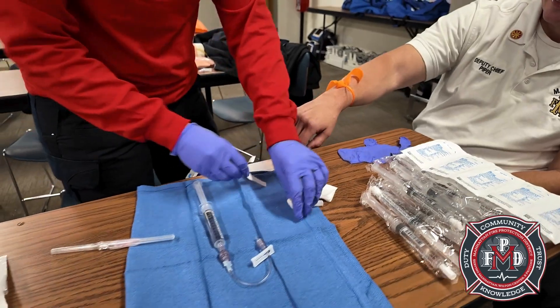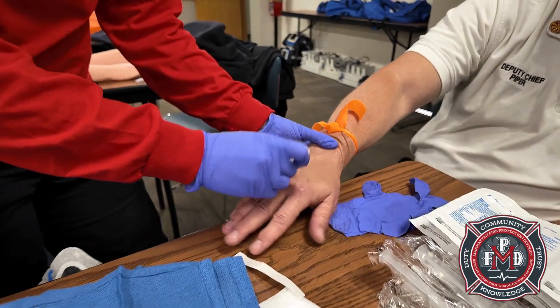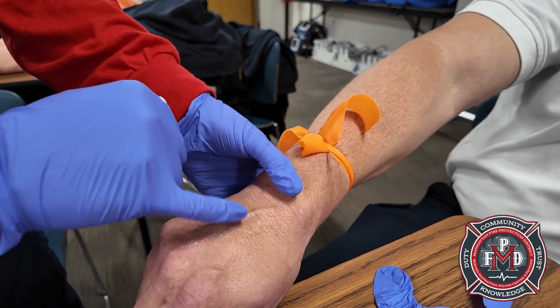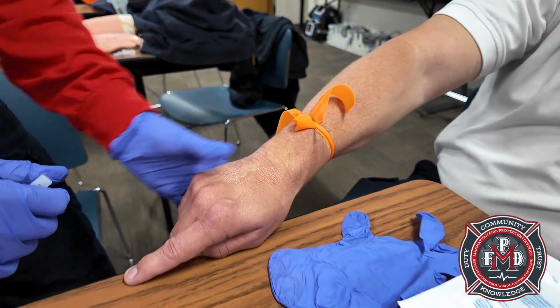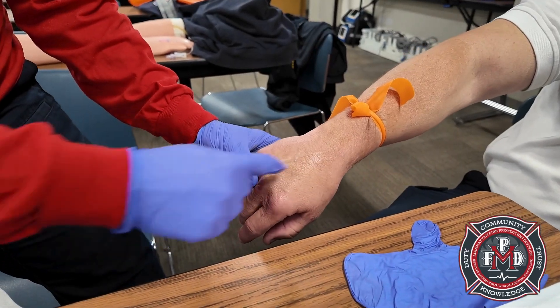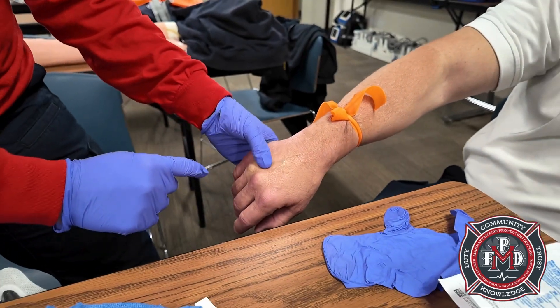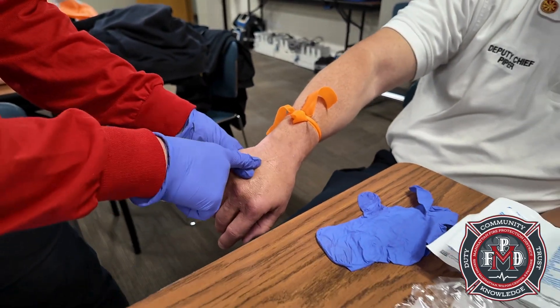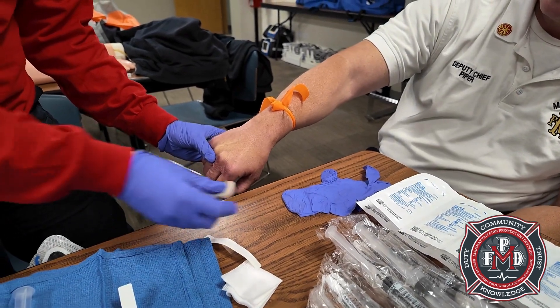He's got a little bit of a rolling vein — look at that. In that instance, you want to hold the skin taut and pull down so it's not moving as much. And just like Chief Piper said, get your thumb out of the way, because that will redirect your angle if your thumb is up too high. Pulling down over the knuckle is best.